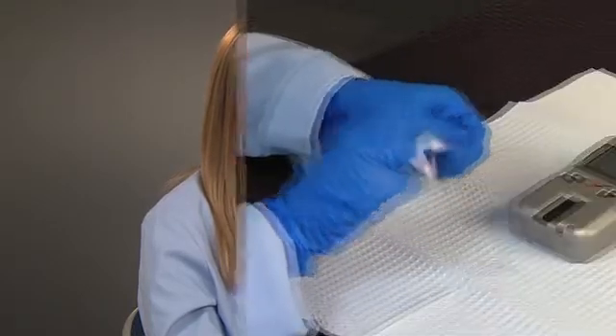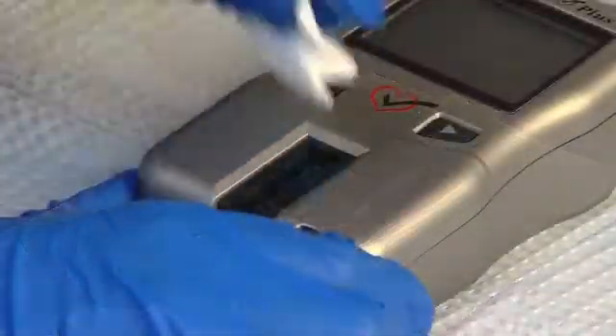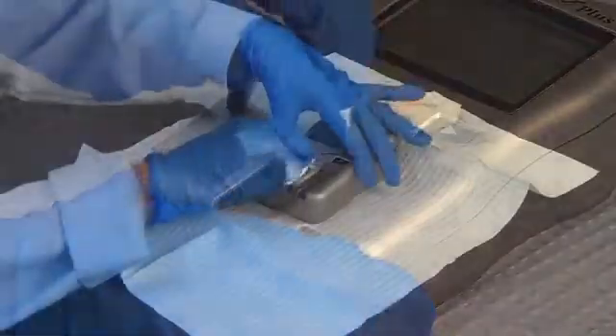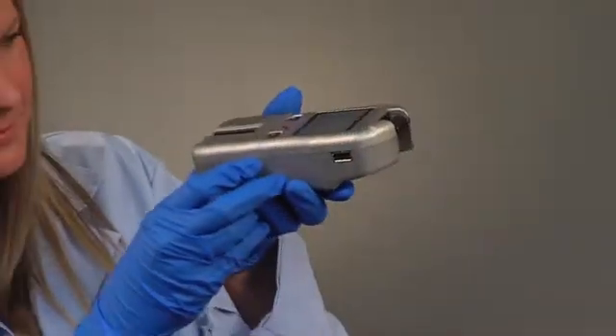Now that you've cleaned and disinfected your analyzer and you're set up for your next test, you'll need to clean the optical glass. Use an alcohol wipe to carefully clean the glass and remove any dry disinfectant, then use a gauze pad to dry it. This is also a good time to inspect your analyzer for any damage to the glass. And that's it — you're ready for your next participant.